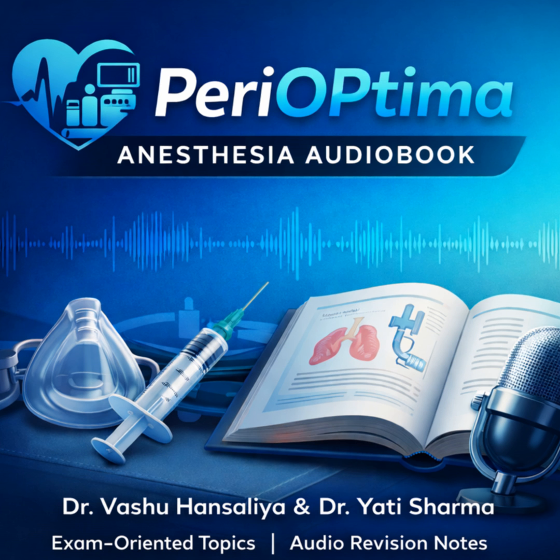So what do you do? You communicate. Surgeon, short bursts only, please. Or you can switch the IABP trigger mode on the console to pressure trigger or internal rate during heavy cautery usage. You have to be proactive. What about arrhythmias? Atrial fibrillation. AF is the enemy of the IABP.